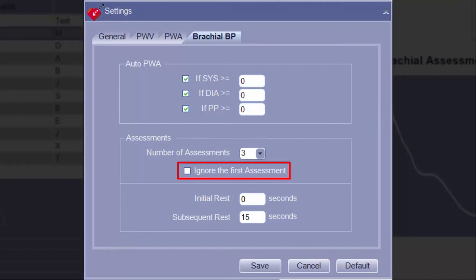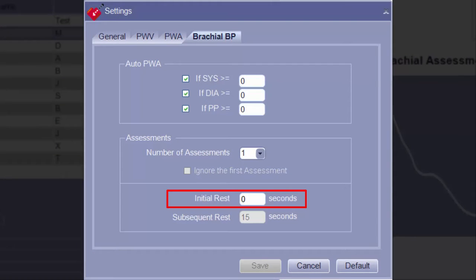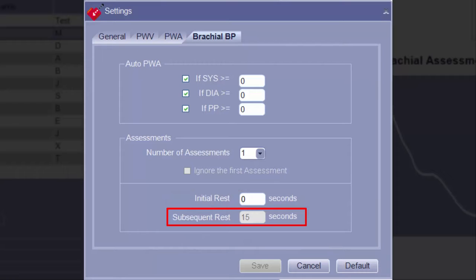If selecting two or more, the option to ignore the first brachial blood pressure from the calculation of the average becomes available. The Initial Rest field can be set to implement a delay before brachial cuff inflation. Once the Start button has been pressed, the software will wait the predefined time before inflating the cuff for the first brachial blood pressure measurement. This field can be set to a maximum of 999 seconds. The Subsequent Rest field is the amount of time in between multiple brachial blood pressure measurements.